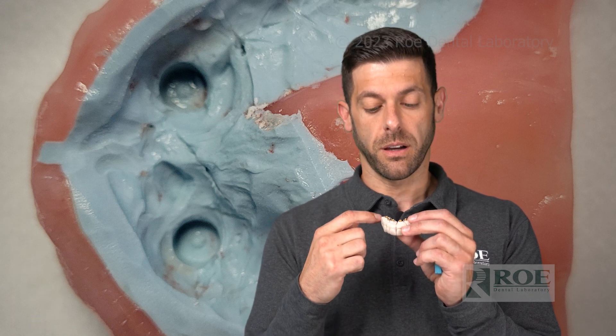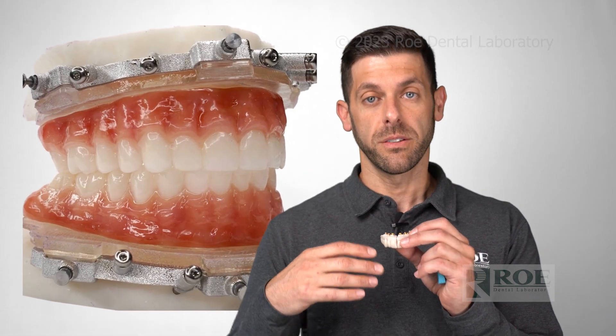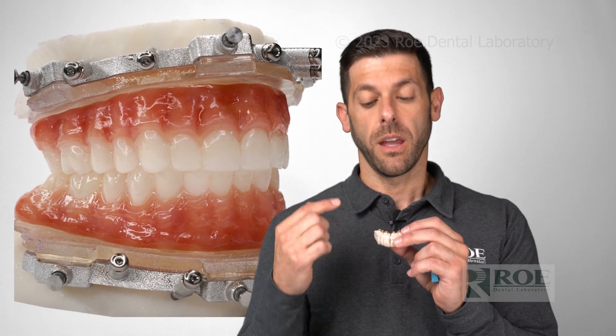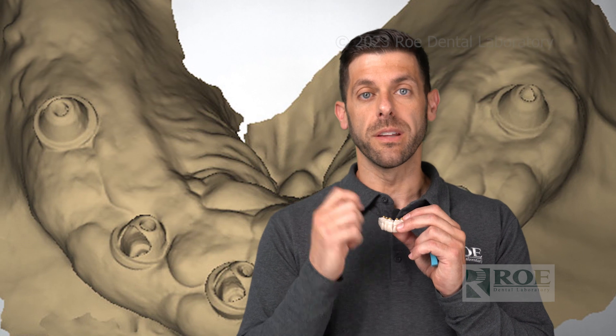If the intaglio doesn't meet the tissue nicely, you can also give us a reline impression — express some medium body in between the tissue and the intaglio, capturing that tissue again. The next prosthesis you receive will have some nice tissue adaptation. If you don't want to use the medium body, you can also, once you remove this, just give us a digital scan of that tissue.